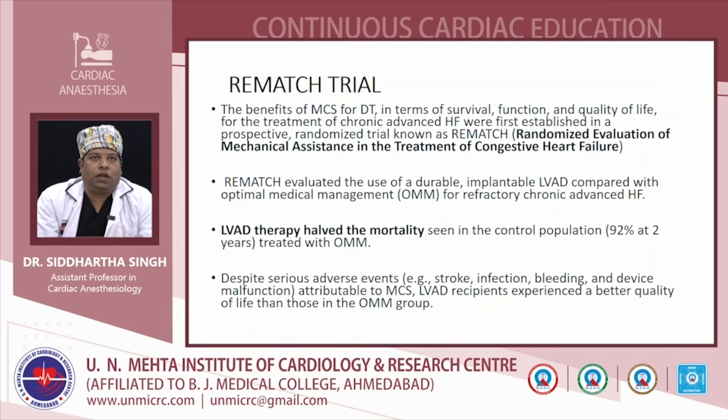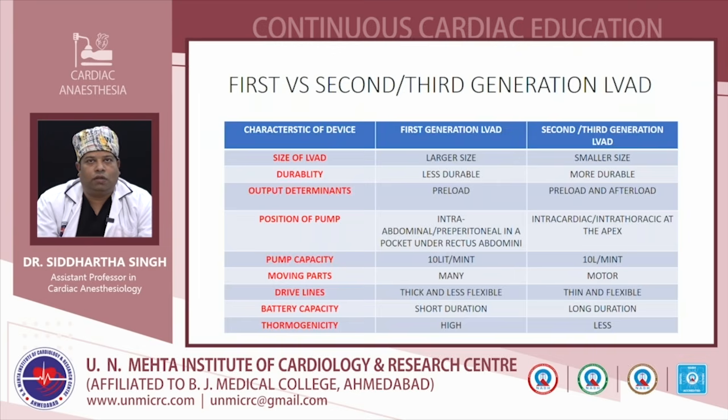This trial showed that LVAD therapy reduced mortality by 50% compared to optimal medical management therapy. But long-term LVAD therapy has some complications like stroke, infection, bleeding, and device malfunction. So these are the complications, and the risk and benefit have to be weighed.